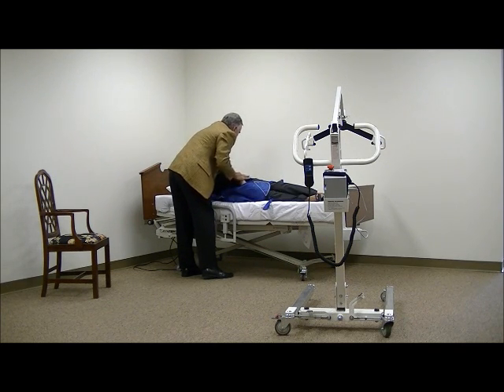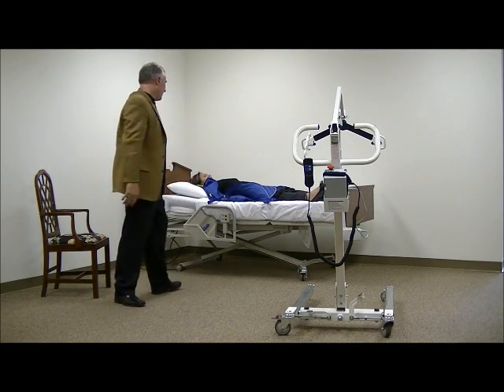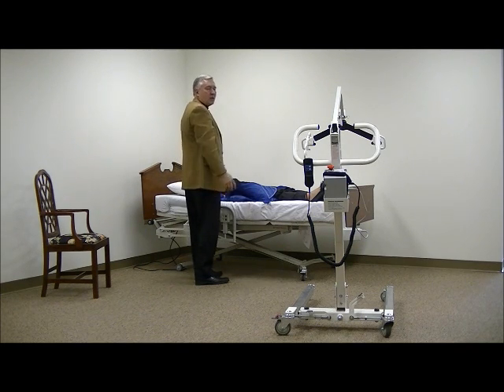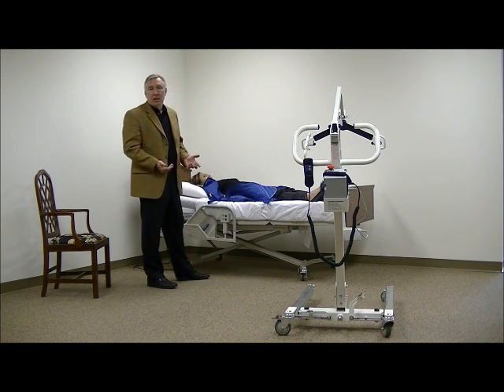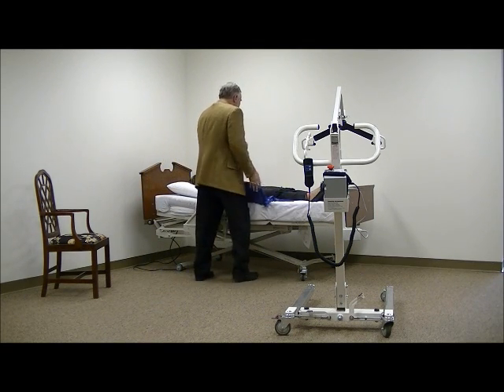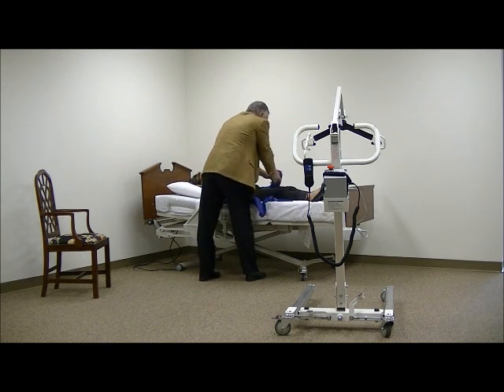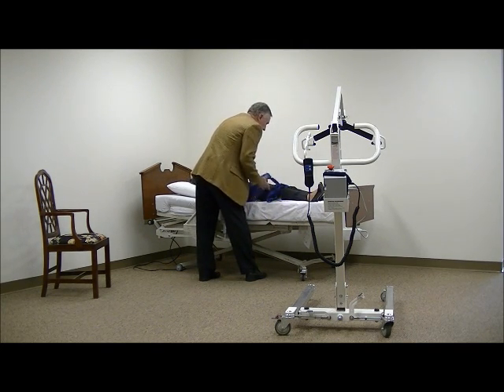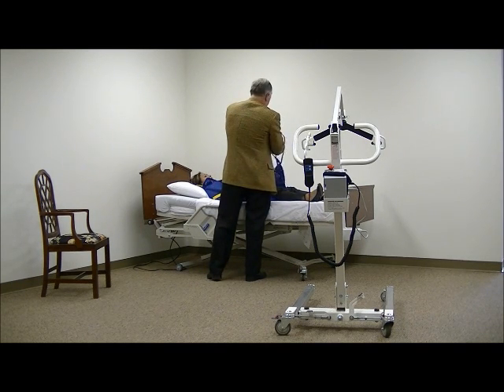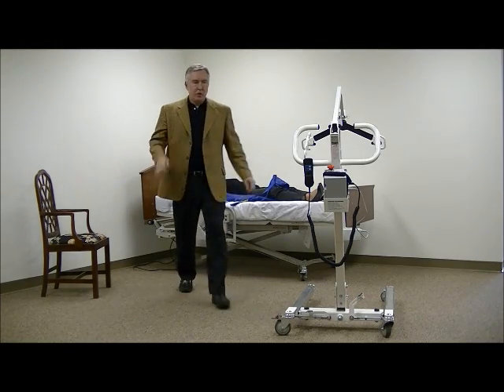So you can see that with this kind of transfer, it's kind of impossible to use perfect body mechanics because of the nature of rolling the patient side to side and applying the sling. So you have to do the very best you can in minimizing the amount of exposure to your back that you have during that process. But once we have the sling in position, the rest of the process is pretty easy. We just bring it between the legs, just like we did before. Crisscross the sling, and now we're going to transfer the patient from the bed to the chair.